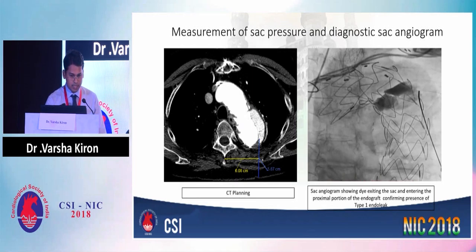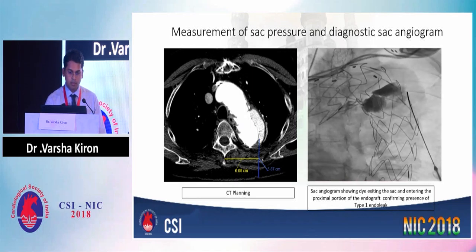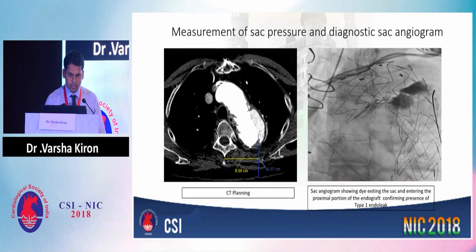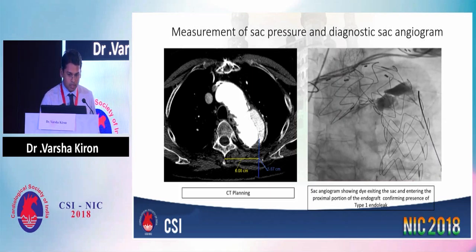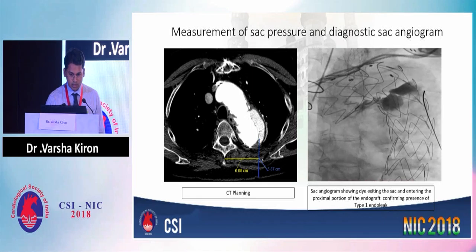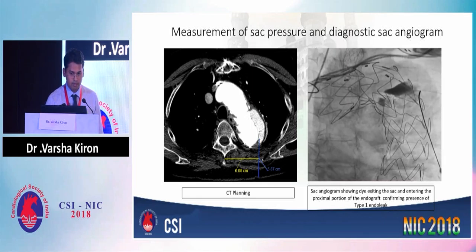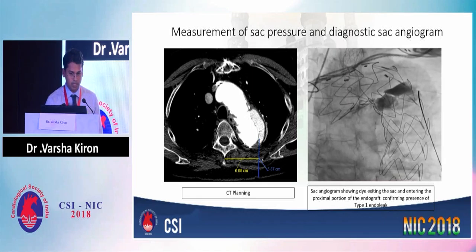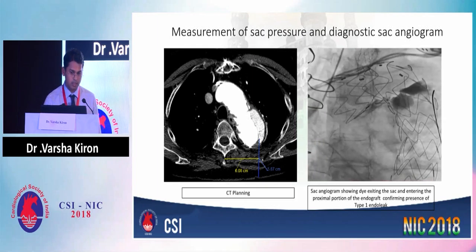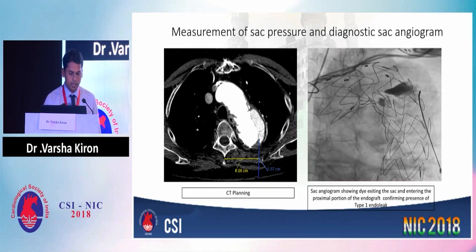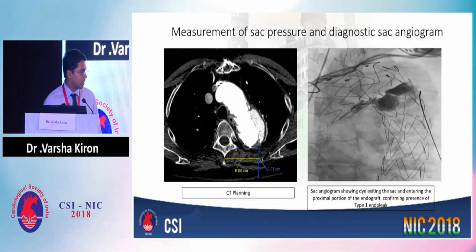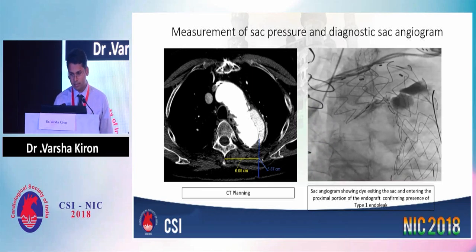The pulse pressure and the absolute pressure are reasonably high, suggesting more of a type 1 endoleak rather than a type 2 endoleak, which would show much lesser pressure and would not be pulsatile. This is the CT planning based on which we entered the sac. This is the sac angiogram — you could see dye exiting under the proximal portion of the graft and entering the aorta, and also visualization of the staining of the thrombus within the sac. This confirmed the presence of a type 1 endoleak rather than a type 2.